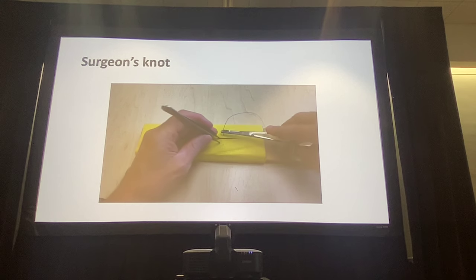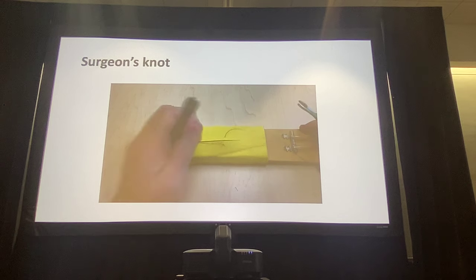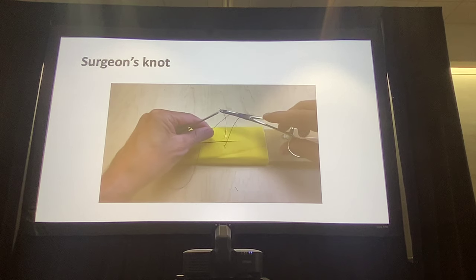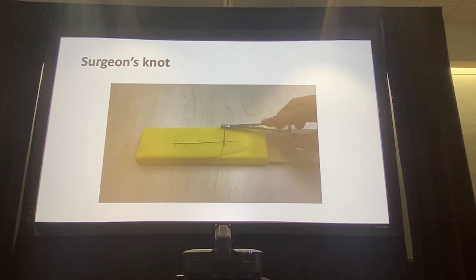The other thing I'll mention, again, it's just things to keep in mind. You'll learn this over time as you do more suturing. You see how he here is taking one pass through. So he places the needle on one side, has it exit the other. What I'd advise doing, get in the habit of, until you do get more confident, instead of going all the way through, take your first bite, pull the needle out, and then reinsert it back into the incision to come out the other end, instead of going all the way through in one pass.